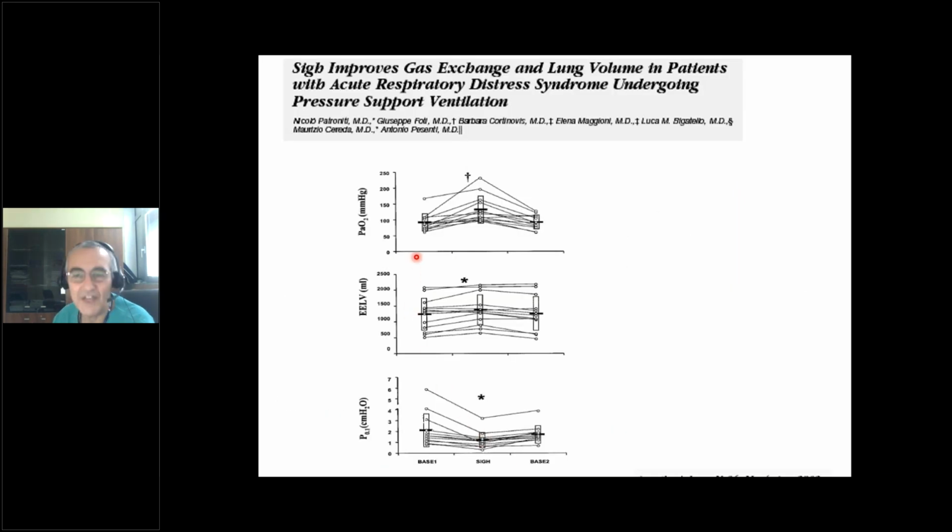And we demonstrated that they are effective in terms of oxygenation, expiratory lung volume and respiratory drive.